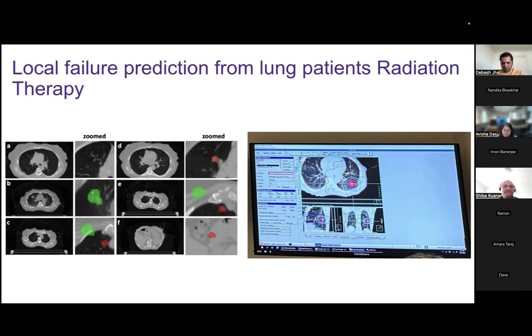In annotations, are there any radiologists or GI clinicians involved in this, or do you just try to find out the segmentation, put a bounding box, find the coordinates, and then apply it for the training? You mean the annotation process?